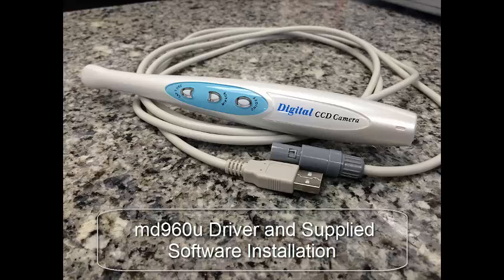In this video, we will install the driver for the MD960U intraoral camera. It's pretty easy, but worth going through step by step to make sure the driver is installed properly. I'm also going to show you how to check that the driver is working properly.